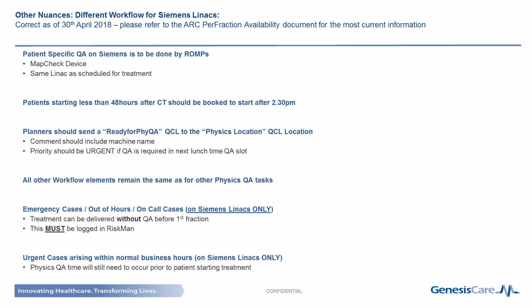the patient starting treatment. A Ready for Physics QA QCL will be created to the QCL location called Physics location. This QCL should include a comment that states the machine name and should be given a priority of urgent if the QA needs to be performed in the next lunchtime QA slot. The workflow and QCL is then the same as for any other Physics QA task.